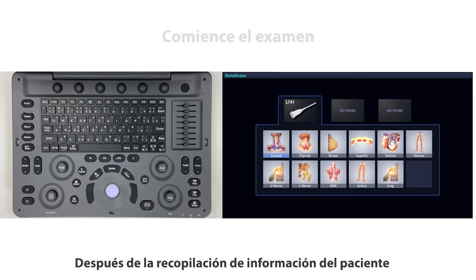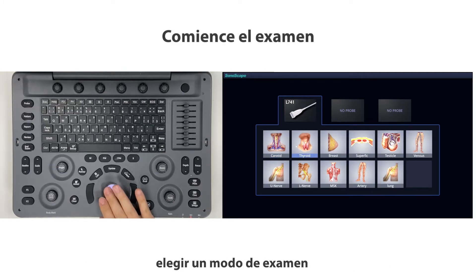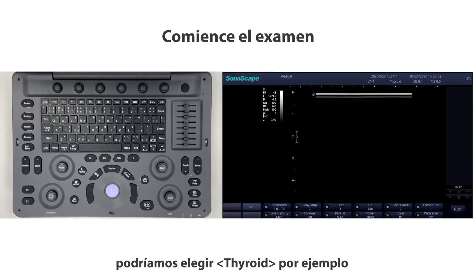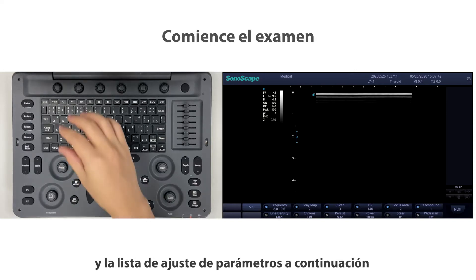After patient information collection, begin the exam by choosing an exam mode. Here is the exam mode display — choose thyroid, for example. It enters B-Mode live scanning, with the image area displayed in the middle of the monitor and the parameter adjustment list below.